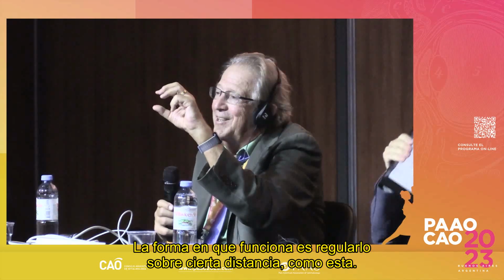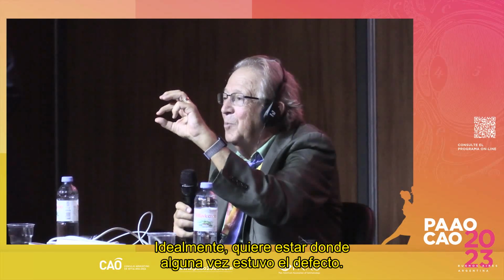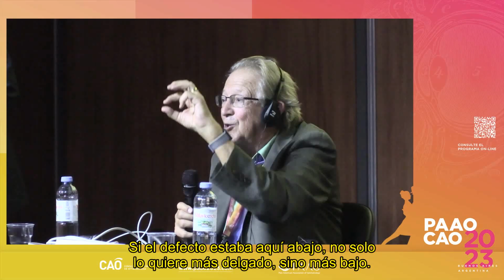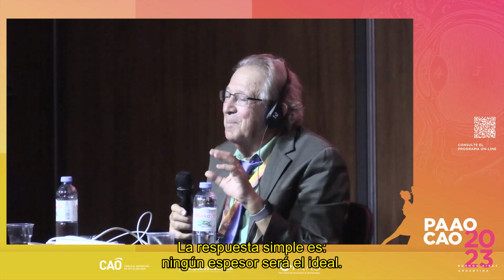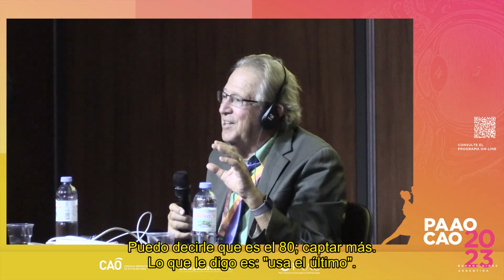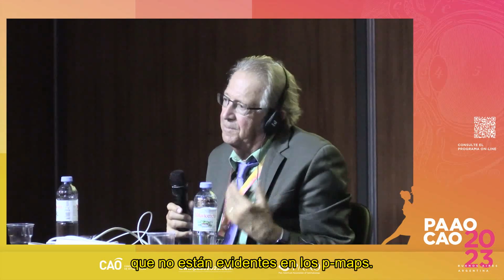So the way it works is you're averaging over a certain distance like this, right? So ideally, you'd want to be wherever the defect was. So if the defect was down here, you would not only want it to be thinner, but lower. If I'm making sense, this is a very advanced question. But the simple answer is no one thickness is going to be ideal. And I can't tell you whether 80 would pick up more. I can tell you I use that last, and I mainly use it to pick up these small defects that aren't obvious on the probability maps.